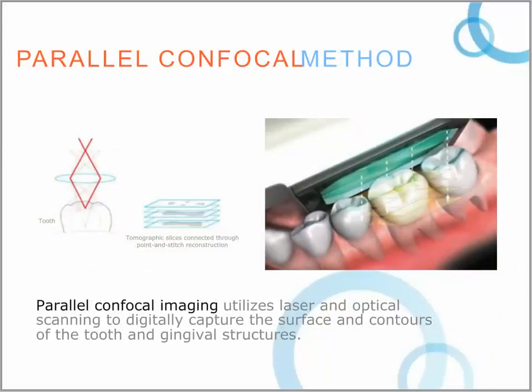Now, in contrast to triangulation sampling is the parallel confocal method.